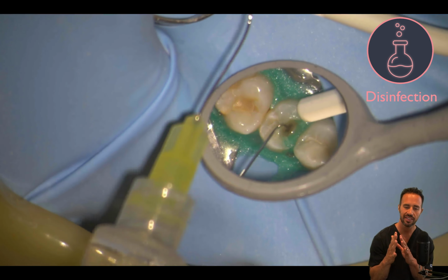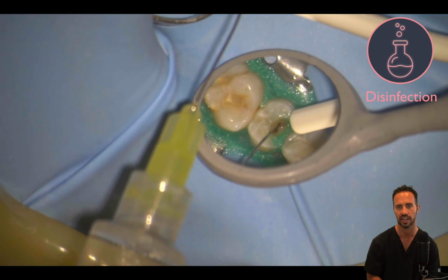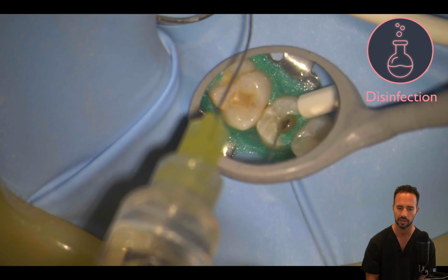So now we're getting into our disinfection stage, all right? So lots of sodium hypochlorite here in the two canals, and then we're going to aspirate out our sodium hypochlorite in both of the canals.